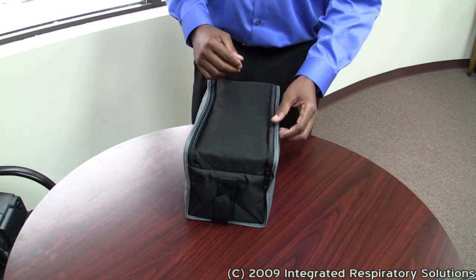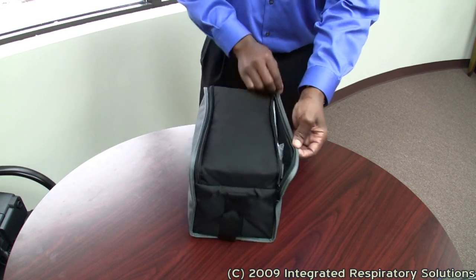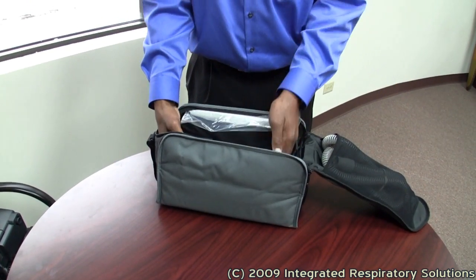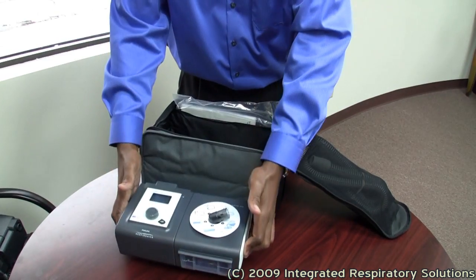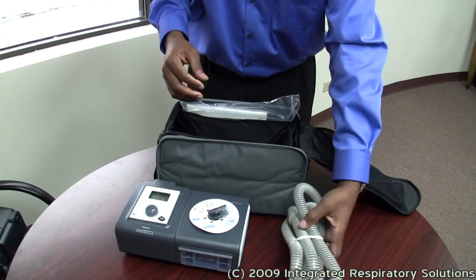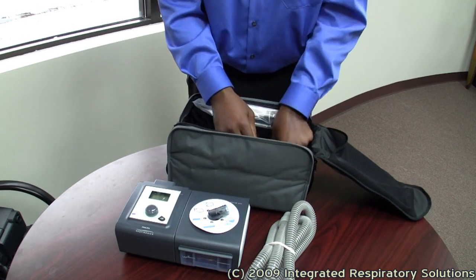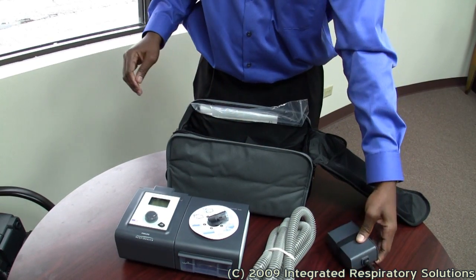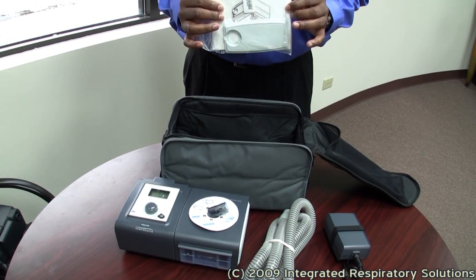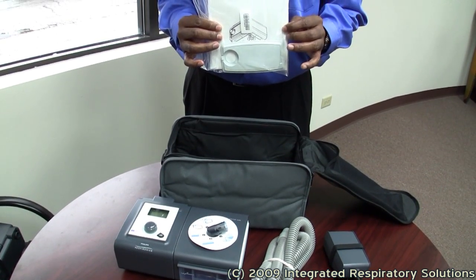Most CPAP BiPAP devices are delivered with a travel case. Within the travel case are your different components to the equipment: your tubing, your power supply, and of course, your instructions. Always make sure you have instructions with the CPAP BiPAP device.